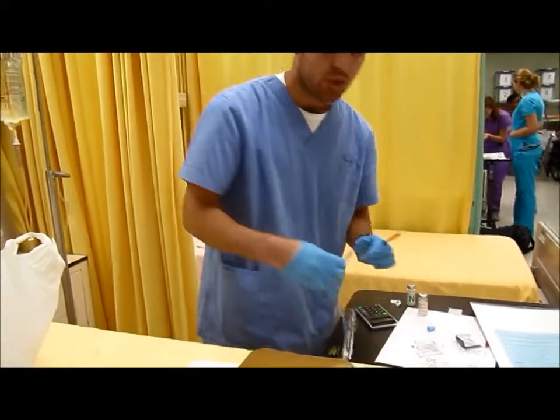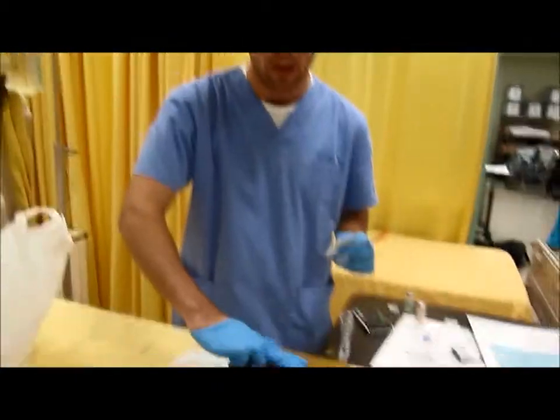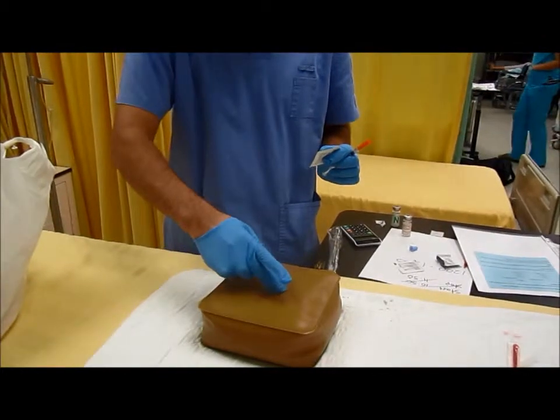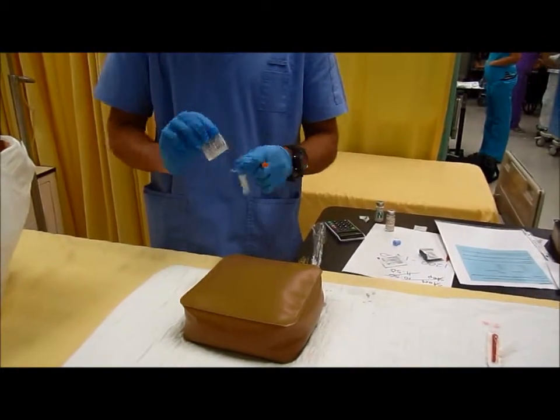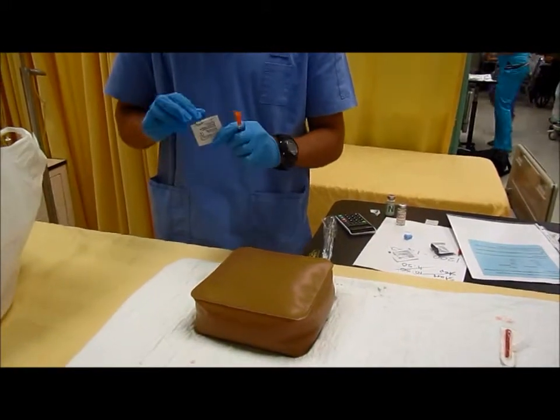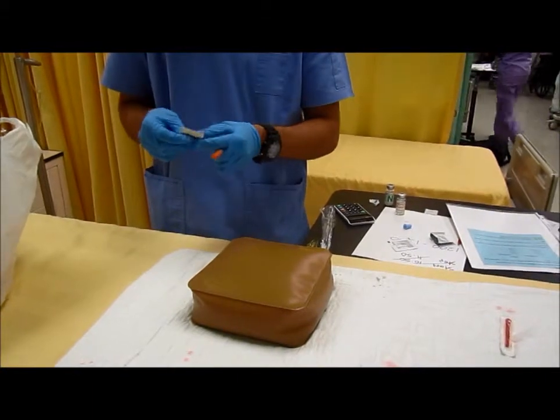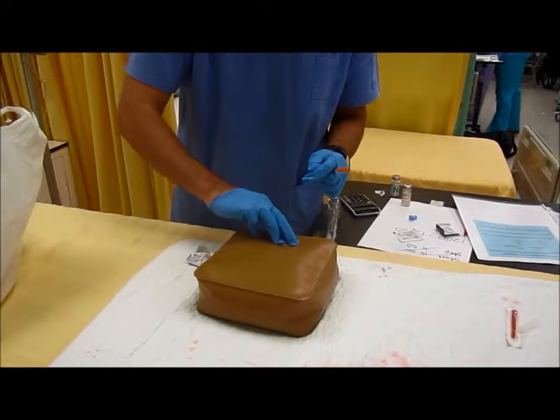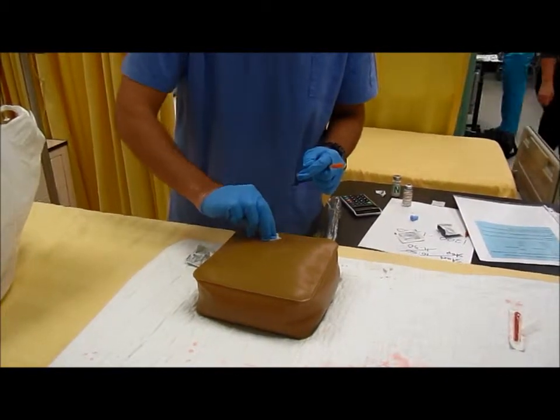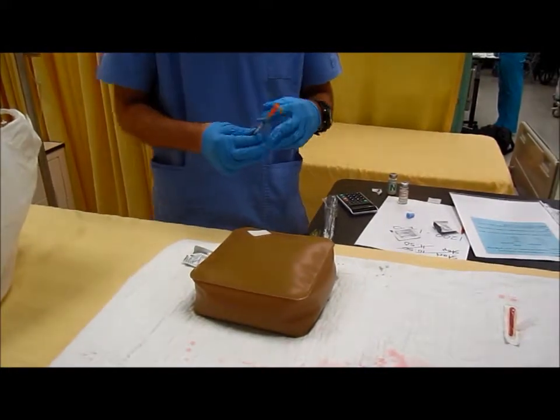Okay. So for a subcutaneous injection for insulin, I'm going to do it around the umbilicus. So it's 2 inches around the umbilicus. So I would just say the umbilicus is right here. I would go like this. So it would go right here. So first I would swab the site, just going around 2 centimeters around in a circular motion. I would mark the swab right there.